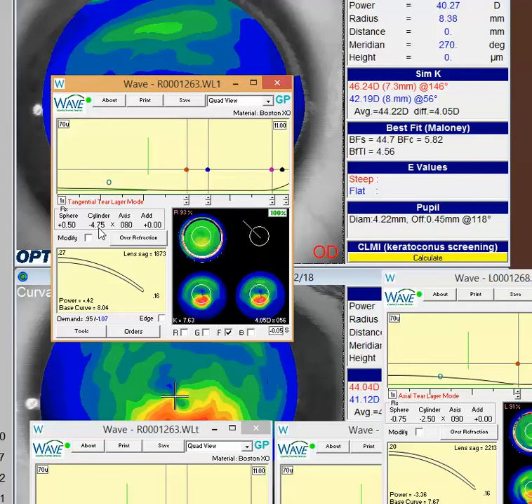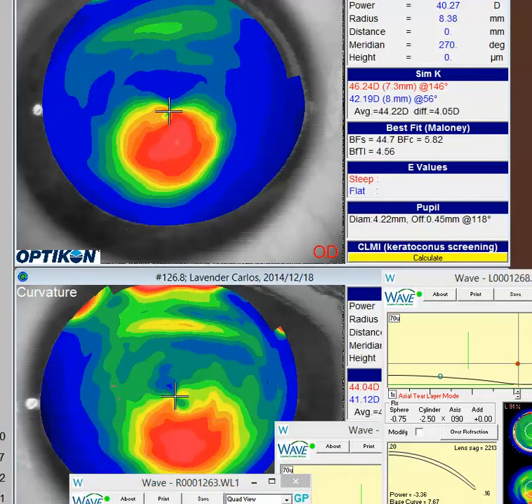So sometimes, in fact, with all these keratoconus patients, before I design my lens, I like to put a known spherical gas perm lens on the eye and get an over-refraction, see if I get a spherical over-refraction, and record that data for the future. When I go design the lens, if I get weird over-refractions, now your right over-refraction was pretty small if I recall, and is mostly spherical. On the left eye, if I remember, your over-refraction was an oblique cylinder, or complicated cylinders, which suggests that you ran into some power issues related to this distorted cornea.